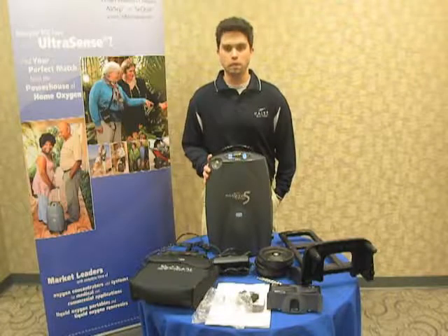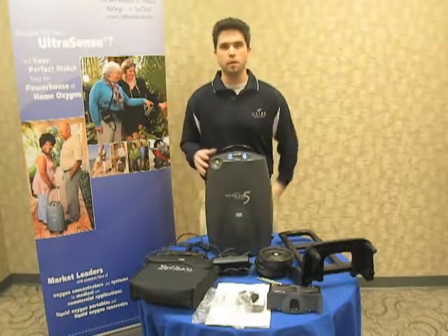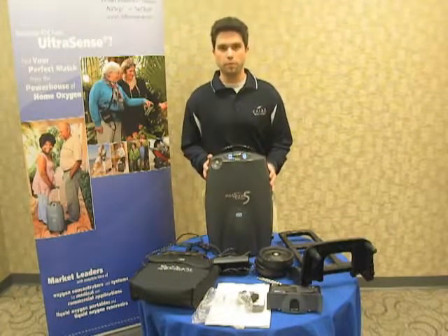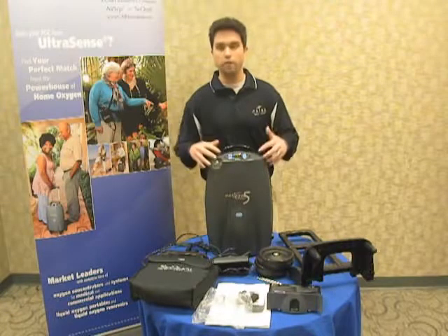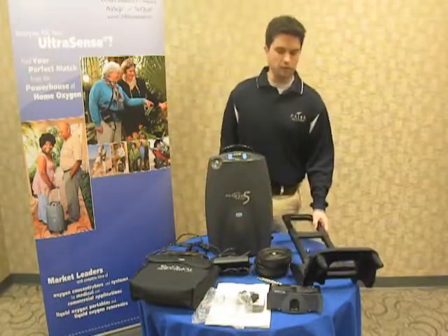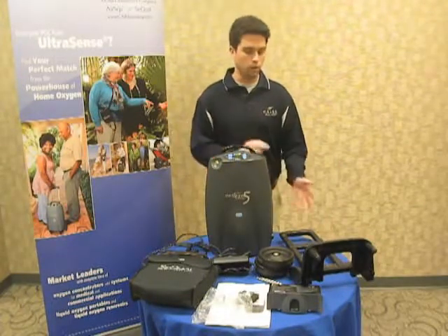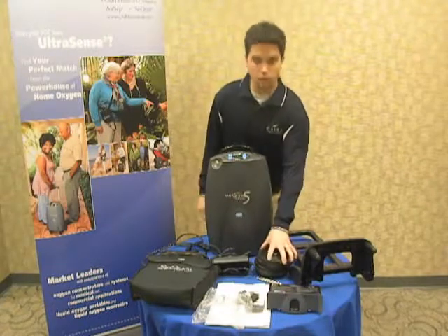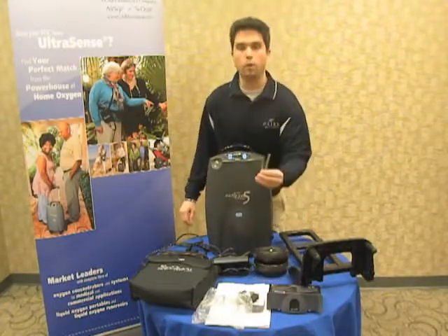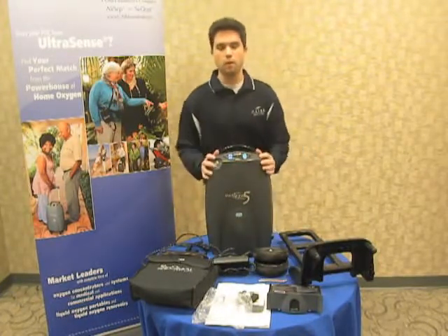Today we're going to go over the initial setup of your SeQual Eclipse 5 portable oxygen system. On the table in front of me, we have all of the components that come with the SeQual Eclipse 5 when you take it out of the box. Obviously, you have the unit itself here in the front. The next component we'll look at is the cart. The cart will go on the Eclipse for portability. The cart does require some assembly. Also inside of the box, you'll have two wheels, as well as some axle rods, washers, and cotter pins. We'll go over the assembly of a cart in just a minute.